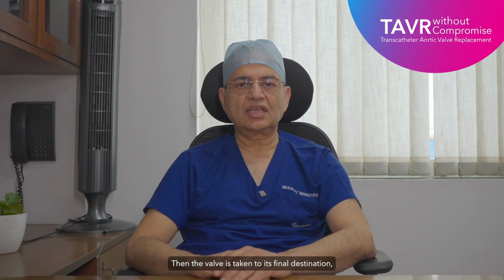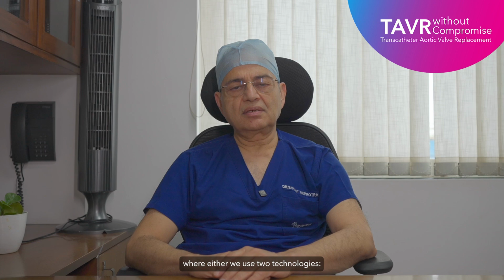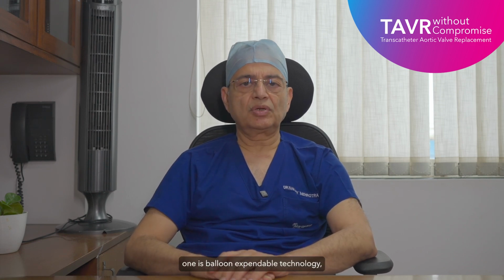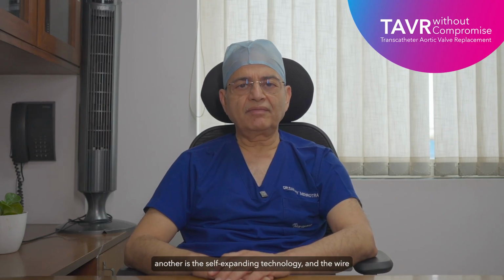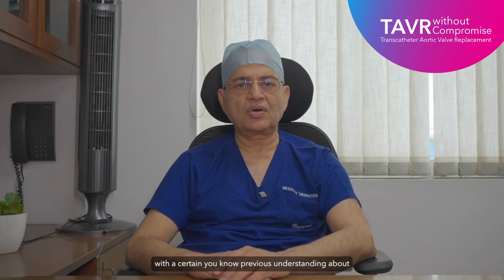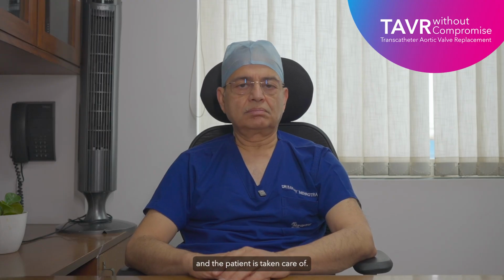Then the valve is taken to its final destination, which is the patient's native aortic valve, where we use either of 2 technologies. Of course, one is balloon expandable technology, another is the self-expanding technology. And with a certain previous understanding about how to deploy and where to deploy, the valve is ultimately deployed, and the patient is taken care of.